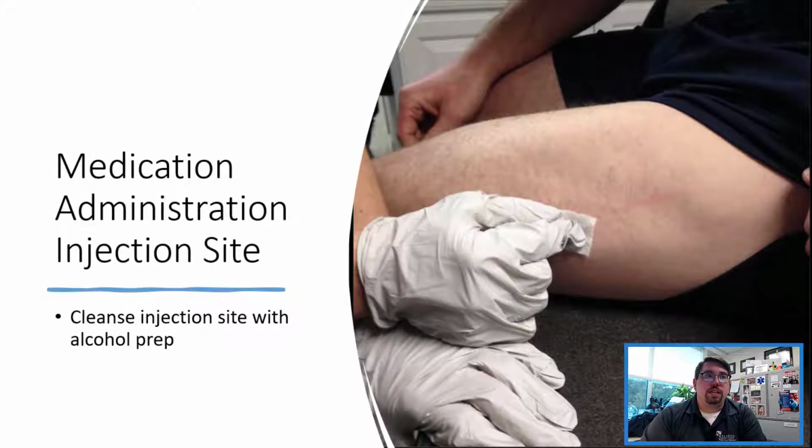When it comes to the injection site, it's important that we clean the injection site with an alcohol prep pad. When we're cleaning, we're going to start with our alcohol prep pad in the center, and we're going to slowly work ourselves in a circle, moving outwards, pulling germs away from the center of our injection site to maintain a clean and sterile environment.